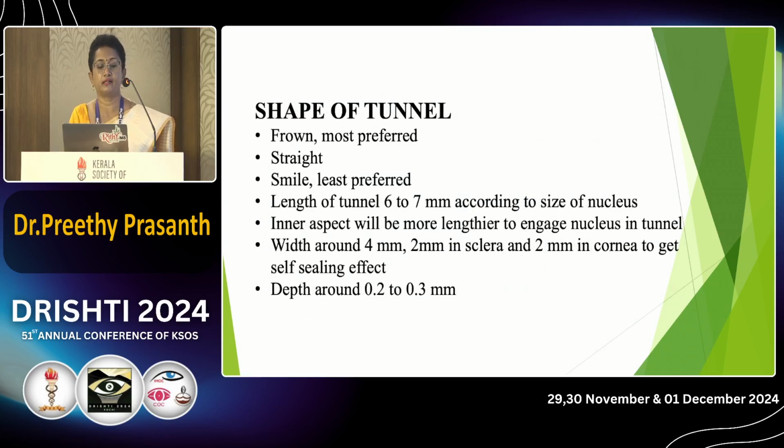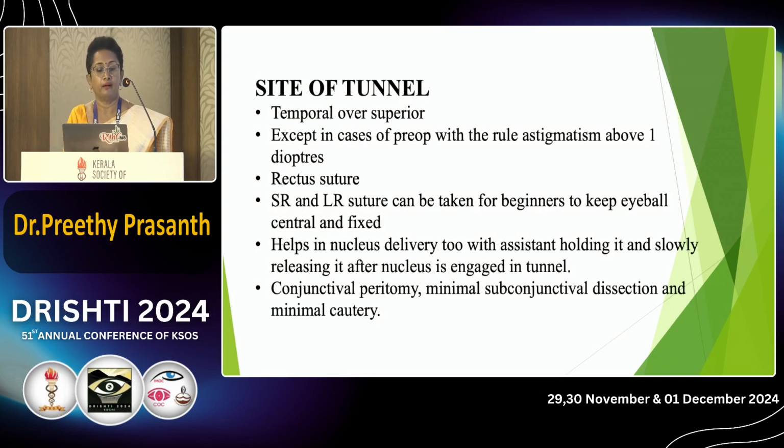Temporal tunnel is definitely better because it helps to obliterate the against-the-rule astigmatism, which is very common in the elderly, and also helps to expose the eye even in deep-set eyes for better tunneling and better nucleus delivery and ease of surgery. So a temporal tunnel can be chosen.